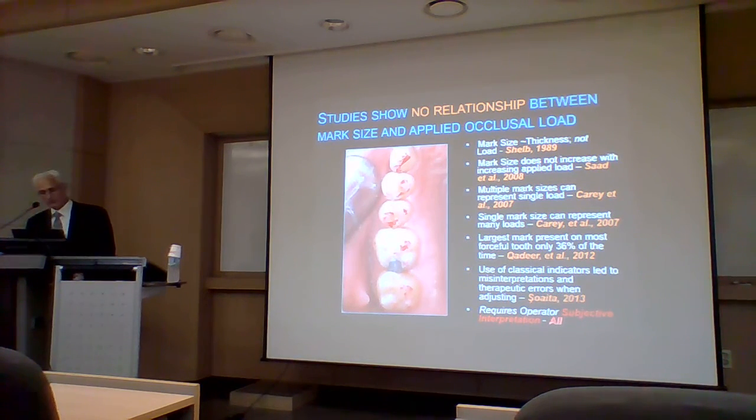So the challenge for us is to know which one is high force and which one is low force. 그러니까 이제 임상에서는 좀 찍고 난 다음에 조정하고 난 다음에 모르고 스캔 안 쓴다고 하면 이제 며칠 지내보고 난 다음에 조직의 반응이 어떤지 보고 알 수밖에 없는 문제가 있는데 스캔 쓴다면은 약 조정하는 그 시점에서도 이제 우리가 결정을 해줄 수 있는 뭐 유용성이 있는 거죠.